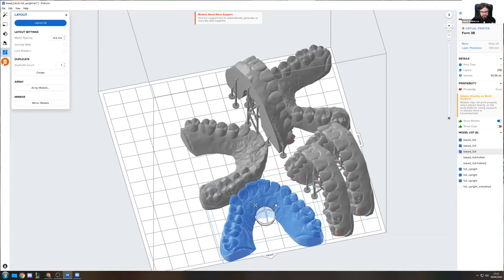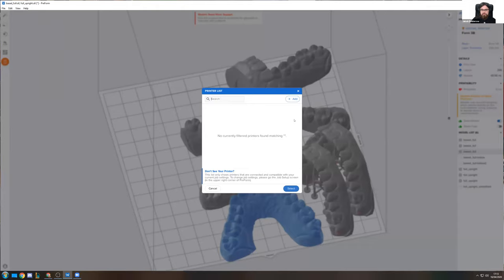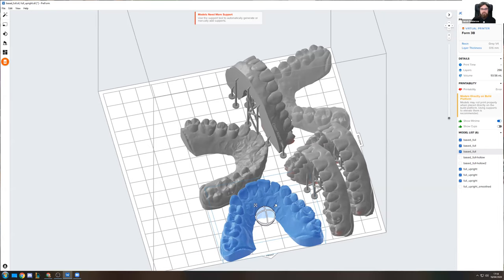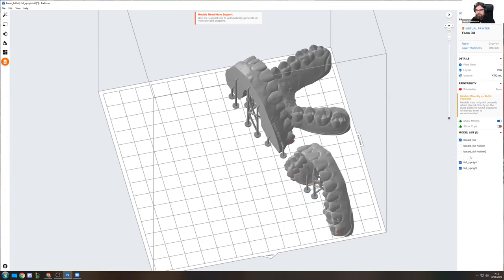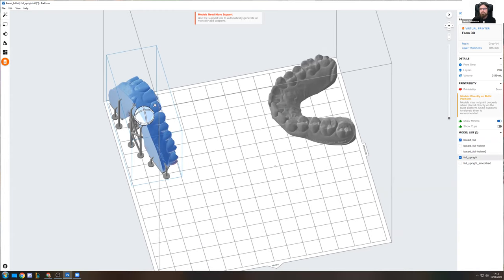And then as a last step, we would go over to this orange button on the left right here, which is sufficiently named Start a Print. From this list, you will select your printer. Mine is currently not in here because it's turned off, but you would select your printer here, upload the job to the printer, and then start it on the printer itself. So this is generally how you would be using the software, and as you can see, it really just takes a couple of minutes.